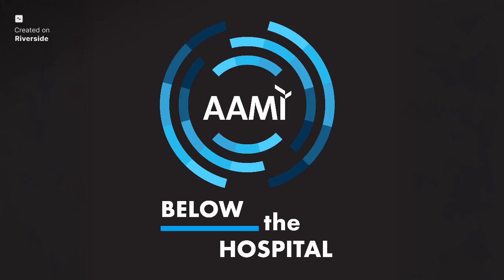So for the second part of it, how is it relevant to the sterile processing professionals, to our SPDs? Instructions for use are essential because they guide the proper reprocessing of medical devices to make sure that they are safe for reuse and do not pose a risk of infection, and they maintain their integrity after cleaning, disinfection, sterilization, storage, basically all the required processes that they go through. It's important that the devices maintain their integrity. Adhering to IFU is crucial for preventing healthcare associated infections and for maintaining compliance with regulatory standards.